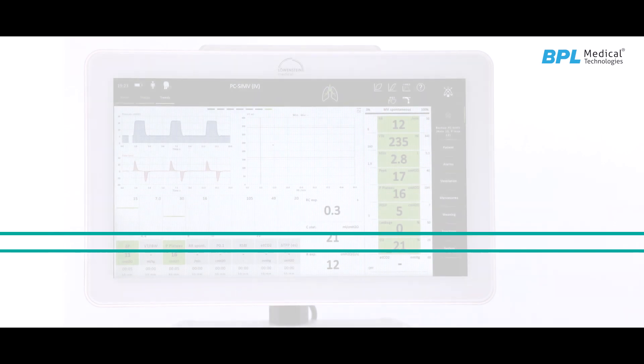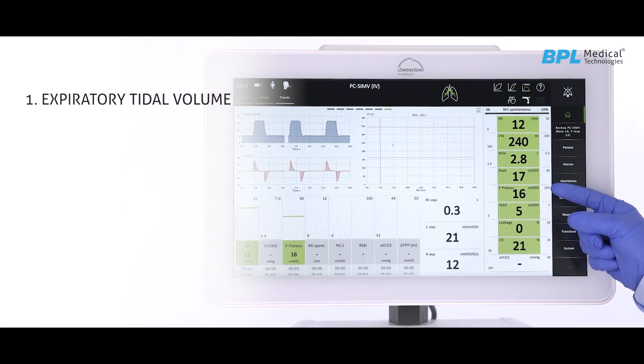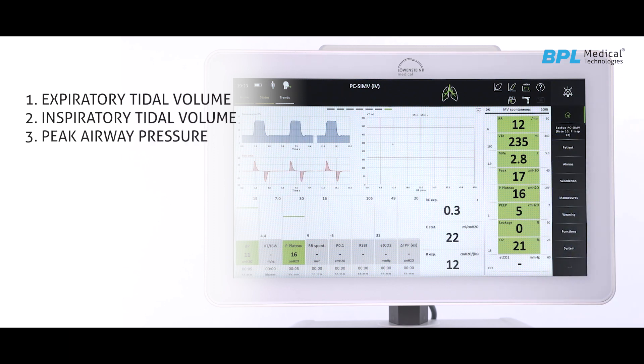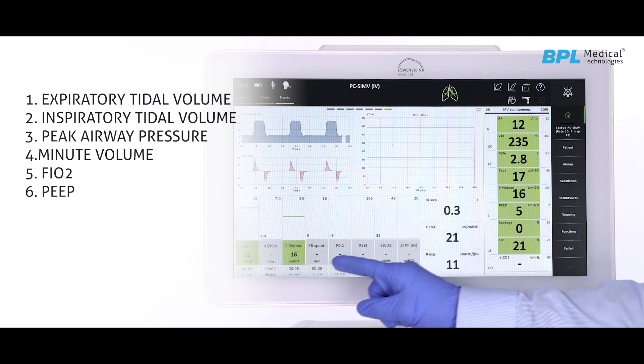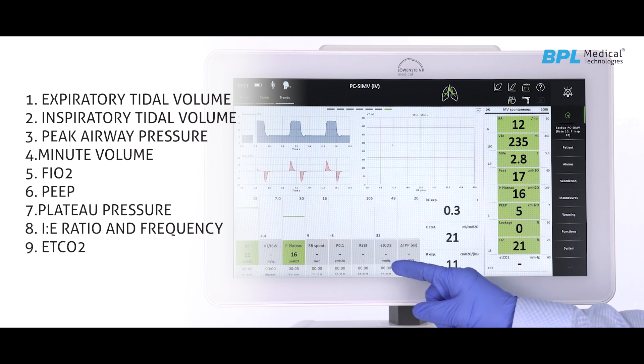The main screen will continuously monitor important parameters such as expiratory tidal volume, inspiratory tidal volume, peak airway pressure, minute volume, FiO2, PEEP, plateau pressure, IE ratio and frequency, and ETCO2.